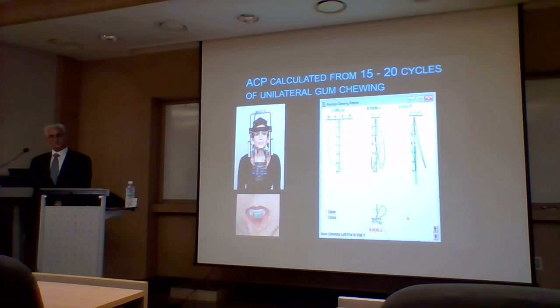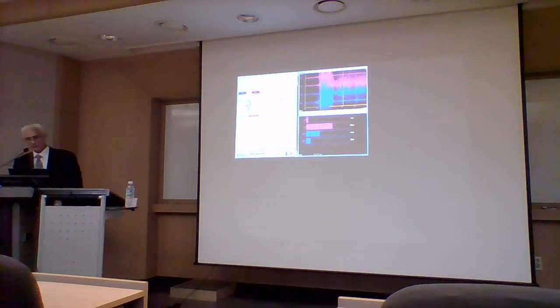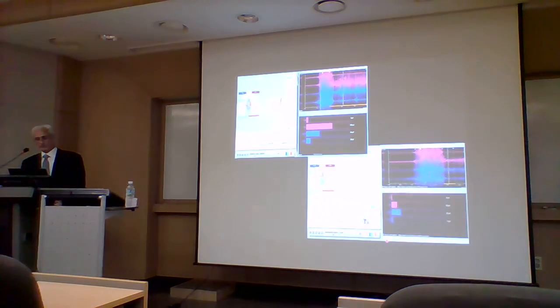이게 치료 전에 하악운동이 저렇게 계산이 된 거고. So then after we would do that, we would measure their disclusion time with the T-scan EMG and treat this high muscle firing. So here's the post-op of that. This is the patient's left excursion, and you see the difference after shortening their disclusion time, how little muscle activity there is compared to pre-treatment.